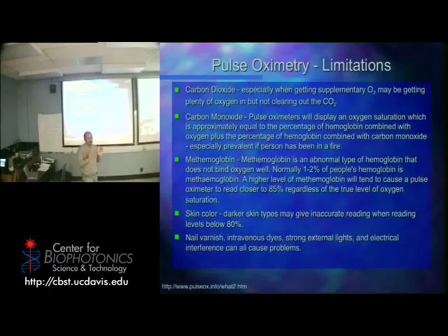The way you discern more species in your blood is you find more points of absorbance to check, and look at those ratios. They are now sophisticated enough to look at 6 to 8 different wavelengths and distinguish methemoglobin versus carbon monoxide poisoning versus actual oxygen saturation of hemoglobin. Okay, good question.